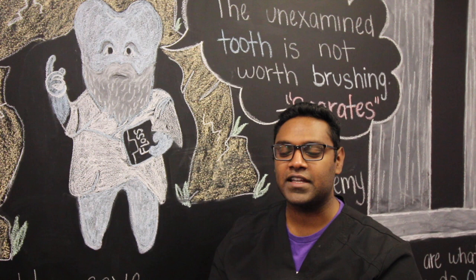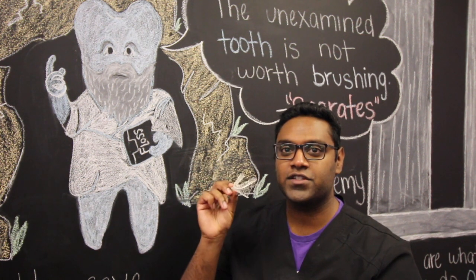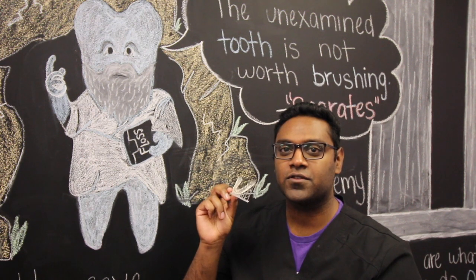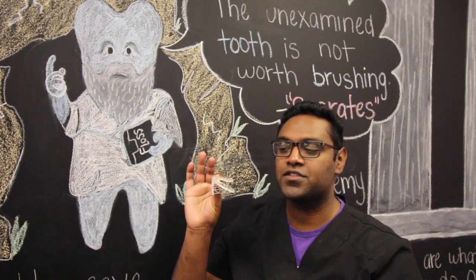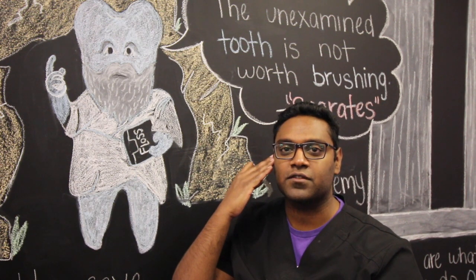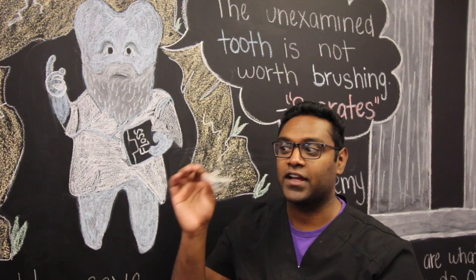Hey philosophers, today I'm going to show you how to make an orthopedic device. It's a rigid splint used to treat TMD, temporomandibular joint disorder, where you have pain near the joints and you have limited mobility. We want to use a rigid splint so that we let the joints kind of rest, and then it will reduce the inflammation and improve function. It won't really get rid of popping sounds, but when we're out of pain, it feels great.